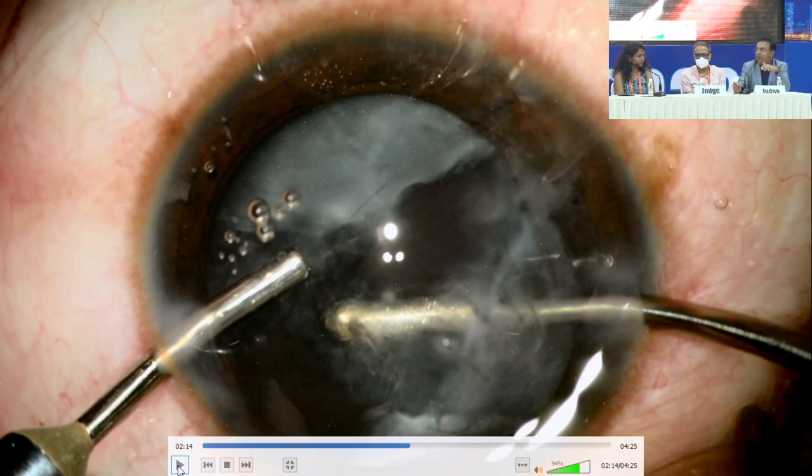But even for people who are quite conversant with it, it makes it much easier because you can identify those fine strands which you won't see otherwise. As far as the cut rates, most machines will have good cut rates now. The only thing is sometimes you should also know how to use the cut first mode, because sometimes you actually need to switch it, and some machines allow it, and then it becomes really nice.